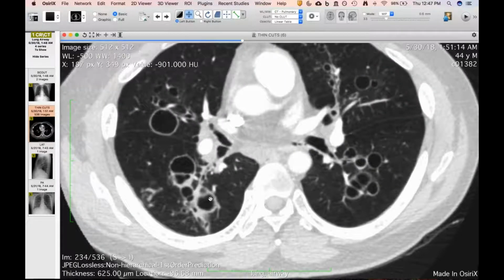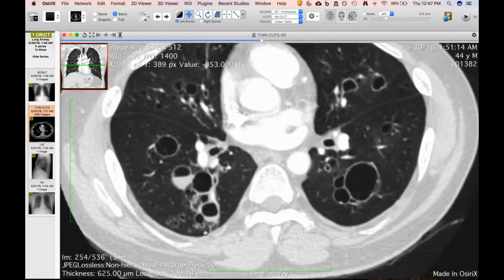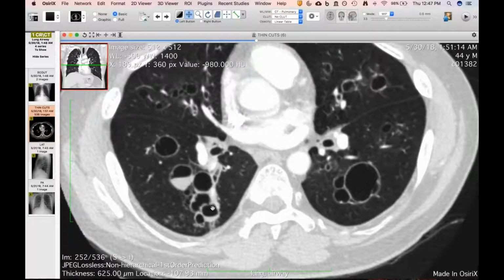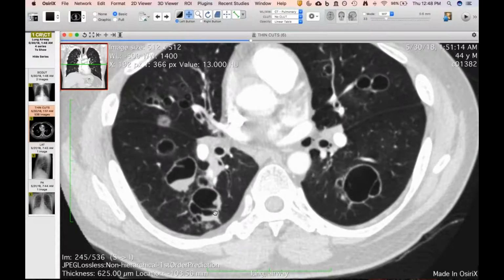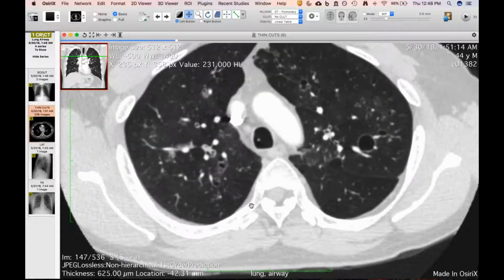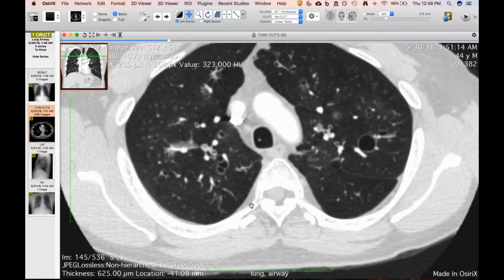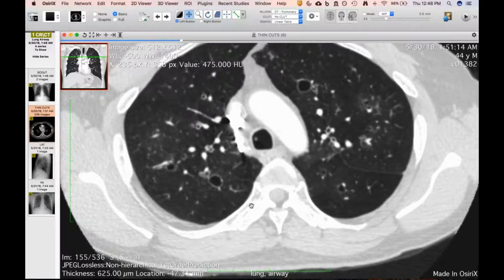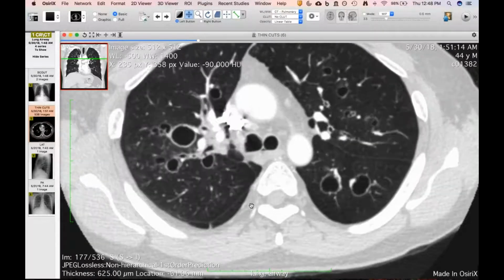This is one of those ones that I've never had a confirmed case of, and I know it's hard to make the diagnosis even on path. With these cases of Mounier-Kuhn or Williams-Campbell, where it's supposed to involve a certain distribution, I find that with age and repeated infection, the airways distal to where the abnormality should really stop get involved, because the more proximal airways get infected, and then you get subsequent infection of the more distal airways, and then they become abnormal and dilated.